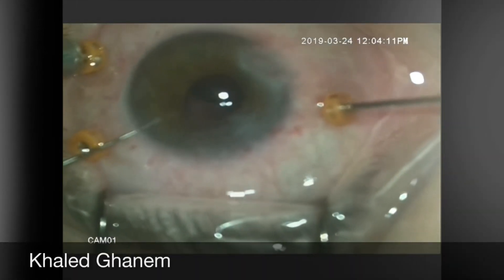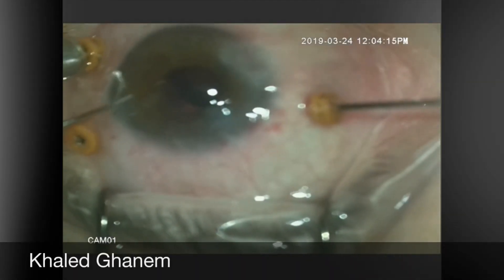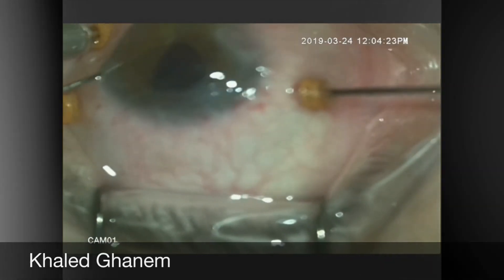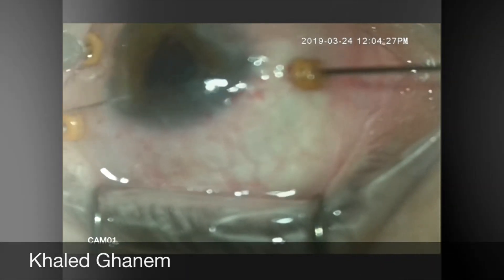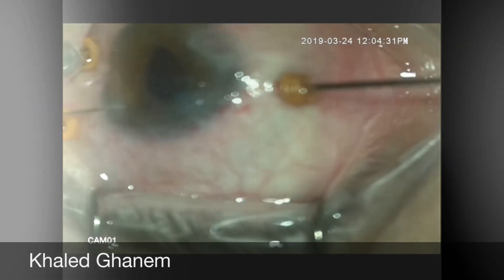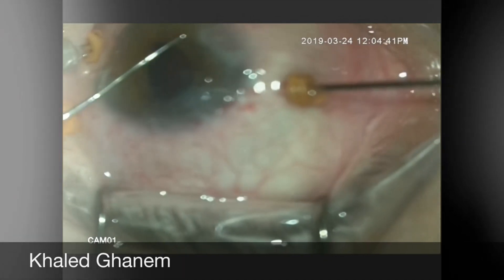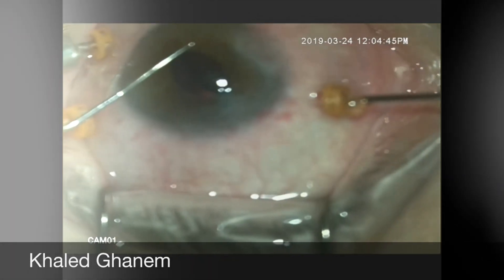The IOL is then picked with the forceps and raised to the level of the iris. Once the IOL is at the level of the iris, we try to exteriorize the IOL at the optic-haptic junction, and the IOL will be kept in place by passing a second instrument at the optic-haptic junction.